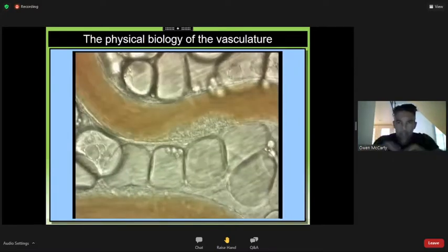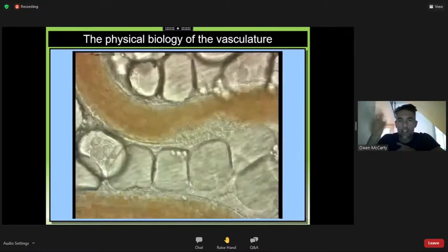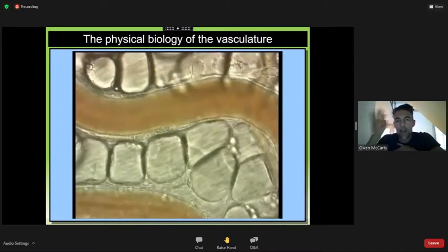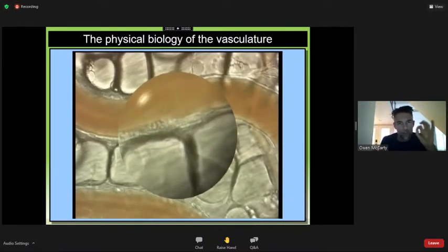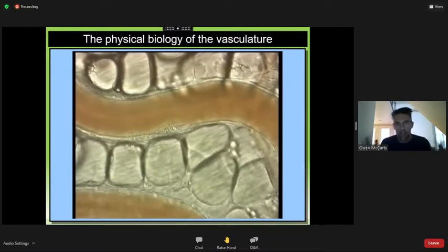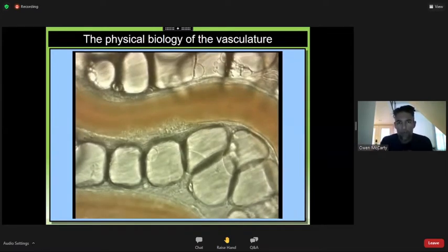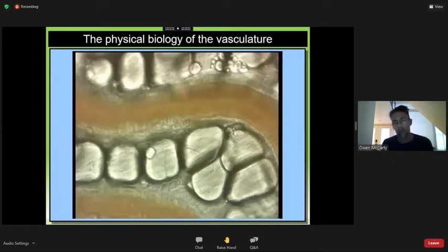And what we did here is we made a little injury. The video will start up again, and you're going to see at the beginning a nice clean little vessel. Then we made a little hole. That little zoom in, now we made a little hole. And the blood cells in the circulation are saying, oh no, there's a hole, and we need to fill that breach so the blood doesn't leak out of that vessel.